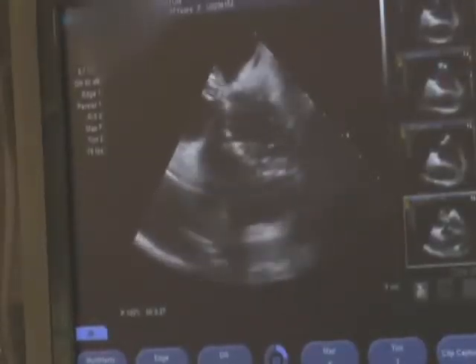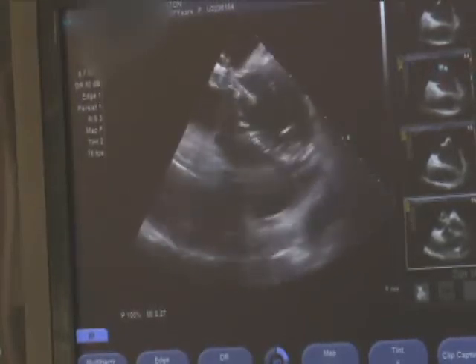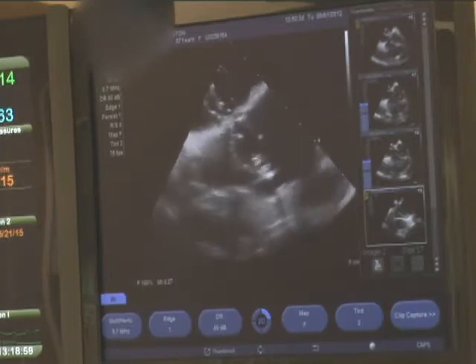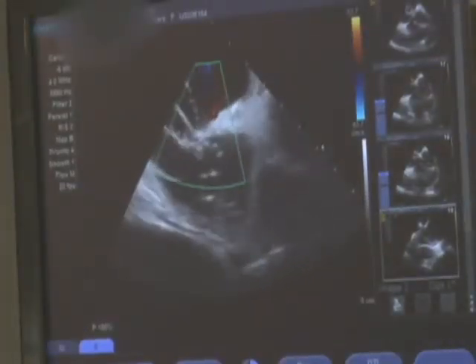Ultrasound confirms the balloon's correct position across the fossa ovalis, and the size of the balloon waist is measured. The balloon position is checked with ultrasound and fluoroscopy, and absence of shunting is confirmed by color Doppler and with a saline contrast study.